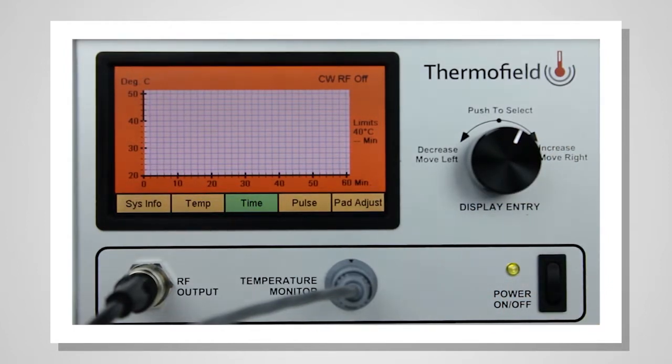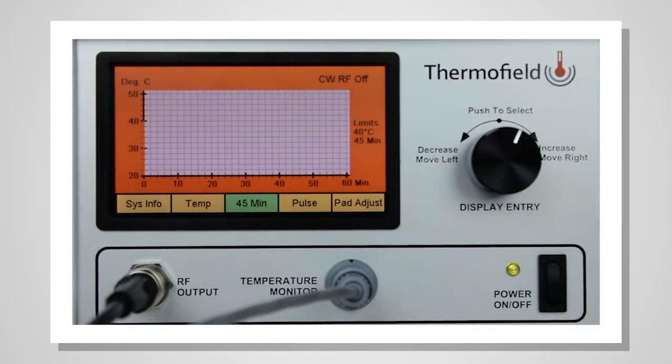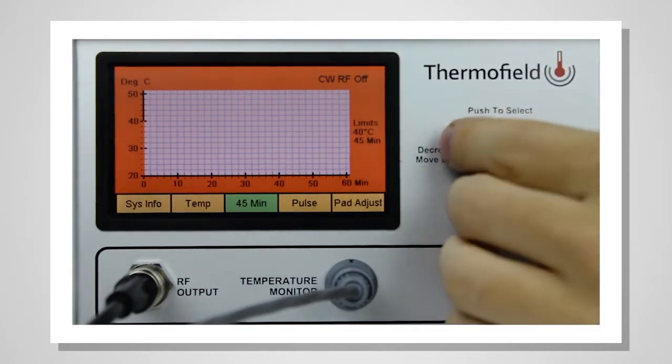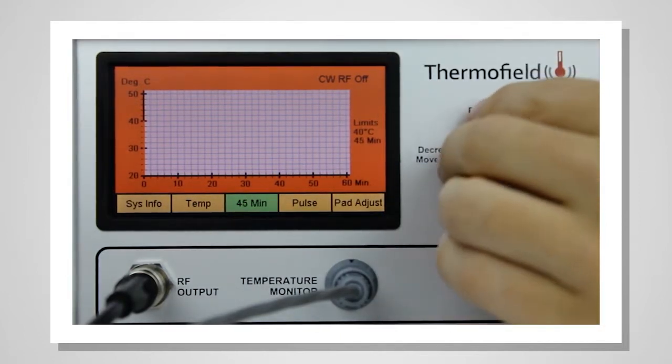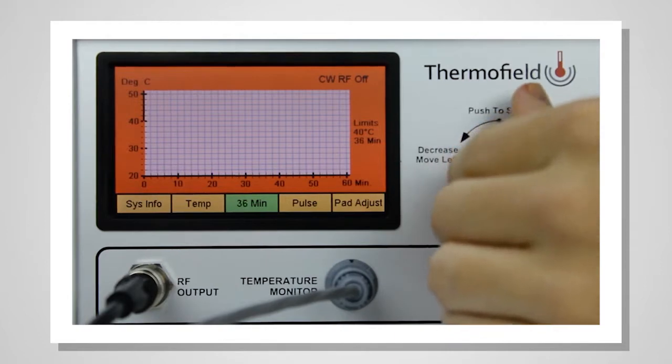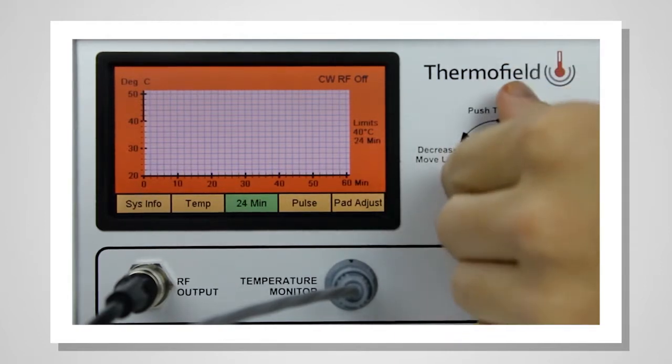The time pane will now be highlighted in green. Follow the same procedure to select the treatment time. Push the selector knob and rotate it to select your desired treatment time. The graph will chart the temperature over time, calculating the thermal density delivered to the patient.